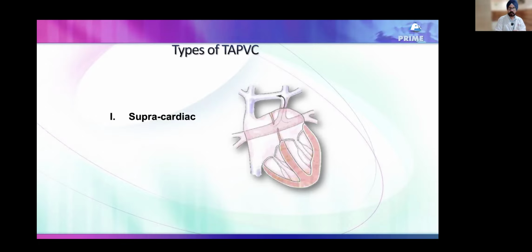So that again is a theory of where this chamber, the posterior chamber, lies, and the LA border. Where does it start in a normal person? That is where you get the cor triatriatum sinister. So you see the cor triatriatum membrane, the membrane which divides the left atrium into two, just proximal to the left atrial appendage.